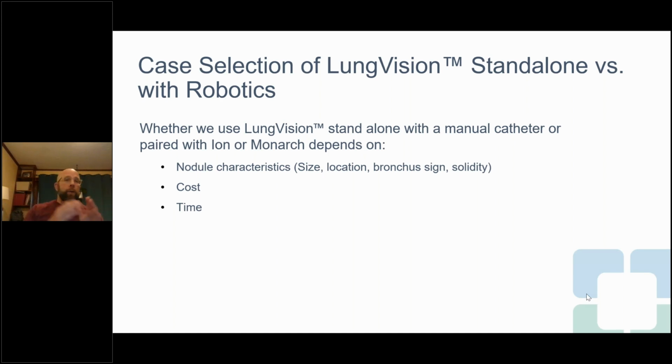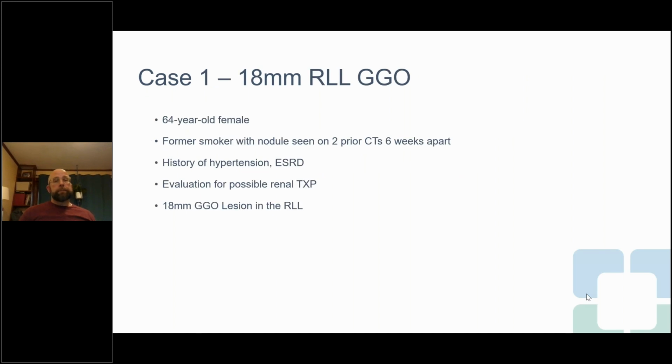And this can be used in any one of a number of technologies, from the thin scope, which you may already have, all the way up to the extravagance of robots. And time is also something that should come into play, right? Even if you're an experienced center that's done hundreds of robots, there is still additional time that leads to the setup, the cleaning, and the breakdown of those robots. And that's time that is precious for most of us.